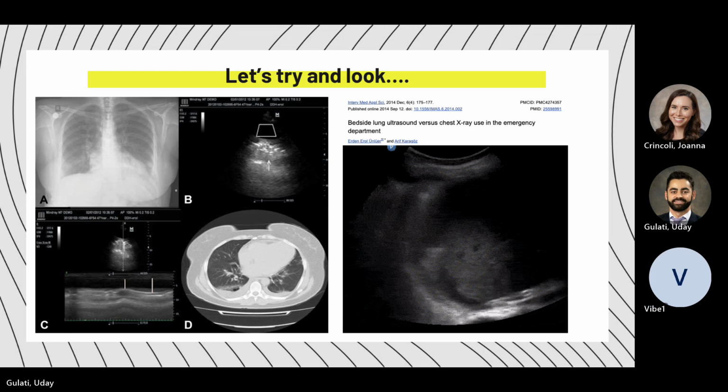So you're saying that maybe there's loss of the left hemidiaphragm, that clear delineation. So maybe you're concerned that this is a pleural effusion. And so you're thinking, okay, maybe I need to start diuresing this patient. Maybe I need to start putting this patient on BiPAP. Anyone else?